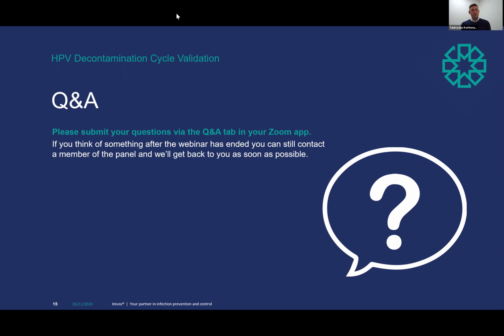And then, Enrico, just from your point of view, I suppose if we're able to control our decontamination cycle parameters precisely, then from a microbiology point of view, we can run validation trials to see what level of efficacy we can achieve. So in a way, it enables us not just to use biological indicators as a final means of saying, yes, we're effective. I think it definitely enables us to see how we can change the cycle to maintain the effectiveness and make it safer and more sustainable going forward.